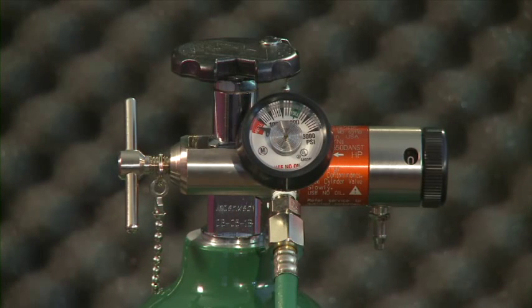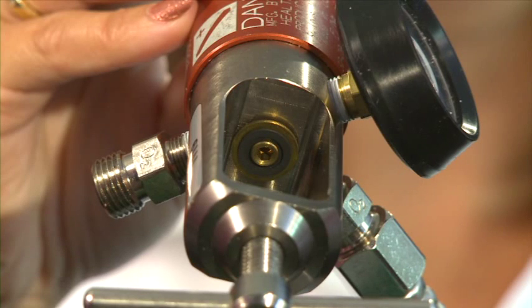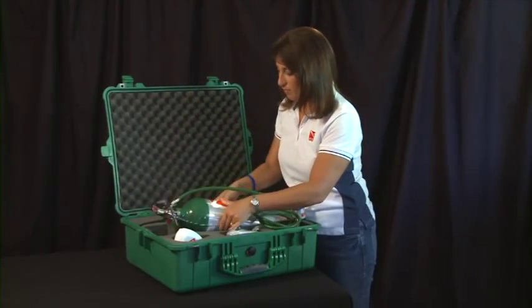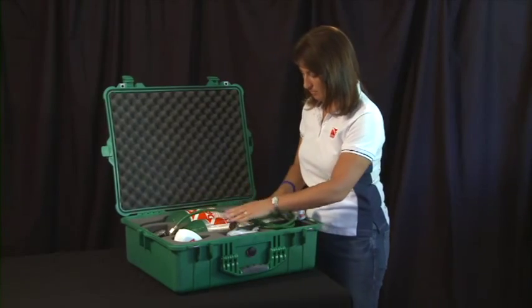If there are leaks, examine each connection to assure proper assembly and tighten connections. If necessary, double-check the condition of the oxygen washer. If the oxygen unit has been used, refill your oxygen cylinder prior to your next dive outing.